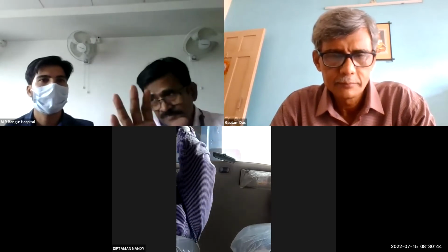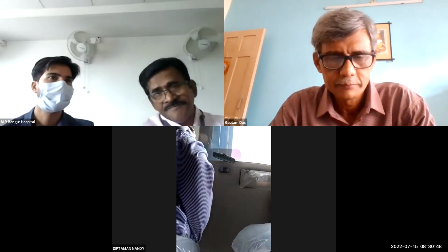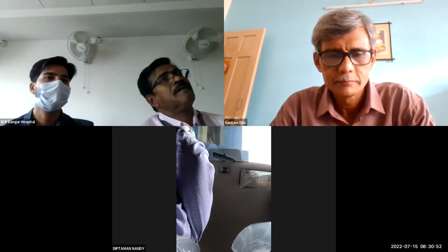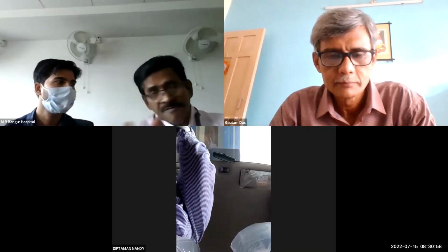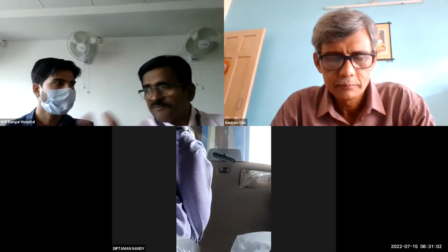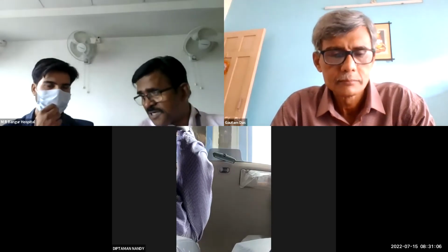Carry on. You are starting insufflation. How long do you continue to insufflate? Sir, when abdominal pressure becomes approximately 12 to 14 mm. You have to set one. It cannot be 12 to 14. Either you have set 12 or you have set 14. If you have set 14, you wait till the pressure becomes 14. If you have set 12, wait till the pressure comes to 12.